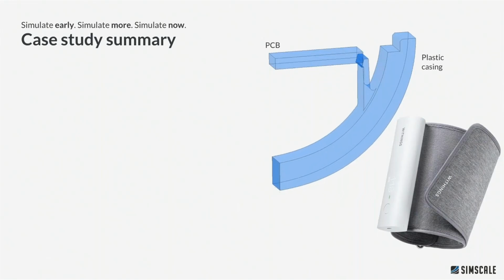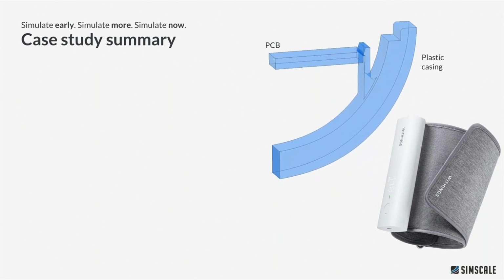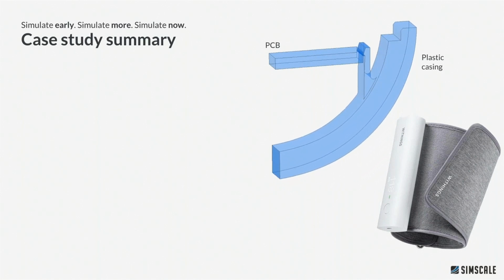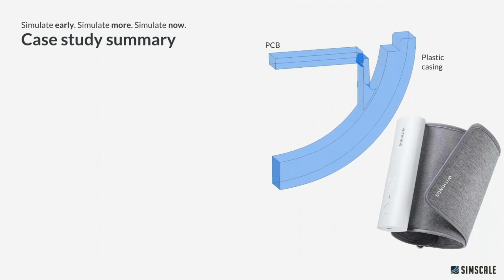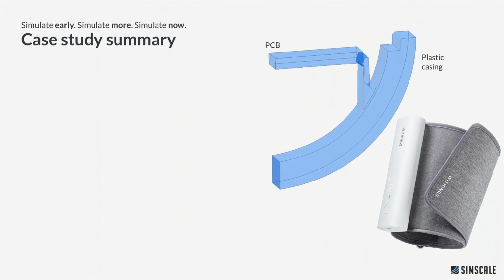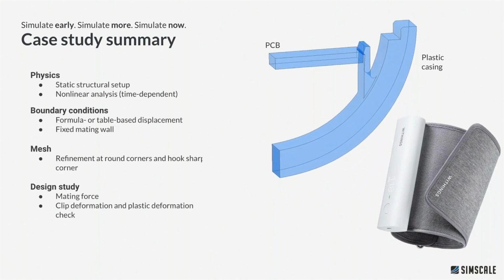In this specific case study, we will analyze a snap fit joint assembled to an electronic board. So if you look at the right-hand side, we have our product, the BPM Connect, a blood pressure monitor, and we are going to take a tiny section of it, which has a clip. So you may see the cantilever hook at the bluish video with a plastic casing going to be assembled to a PCB. So to summarize, our simulation will look exactly as the video on the right.